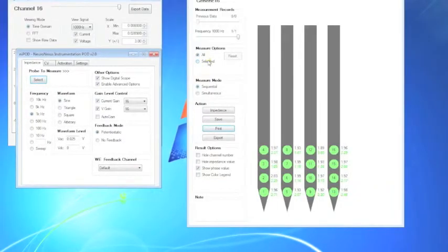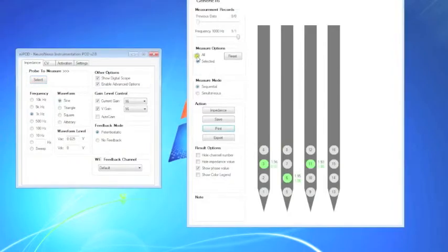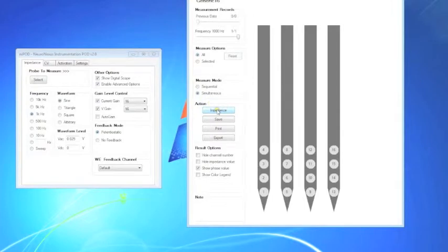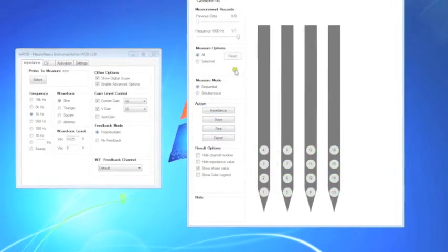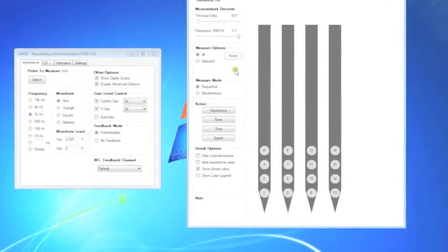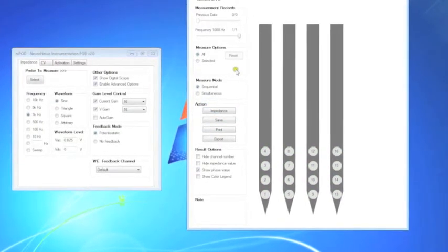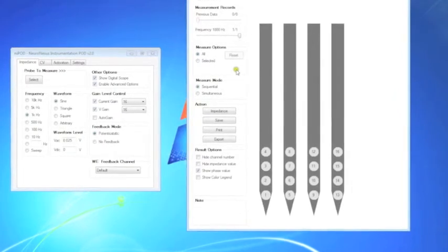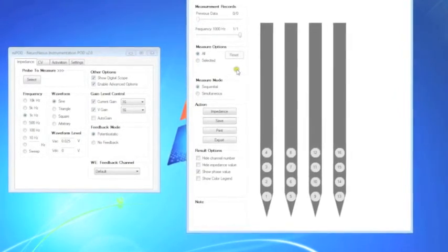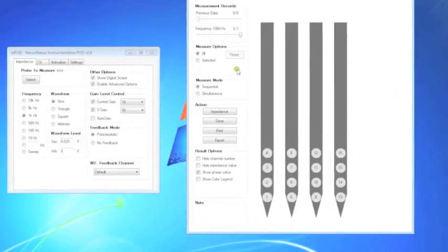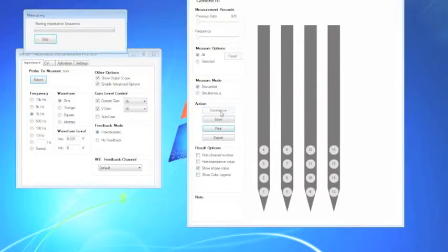For an impedance scan, you can select only the sites you want to measure or measure all the sites in either simultaneous or sequential mode. We recommend measurements in sequential mode as while simultaneous mode is quicker, it may be less accurate.